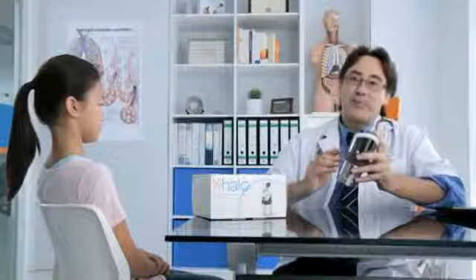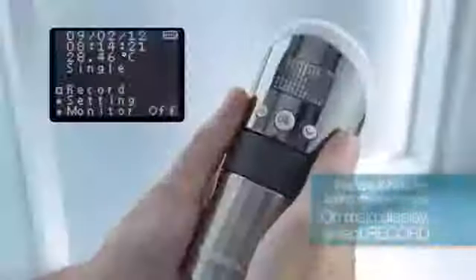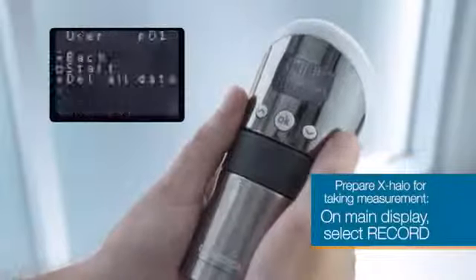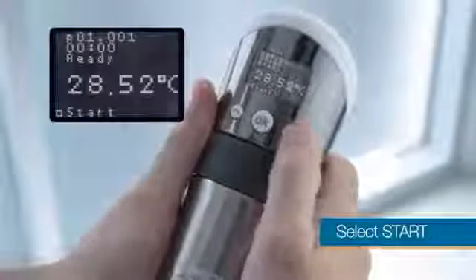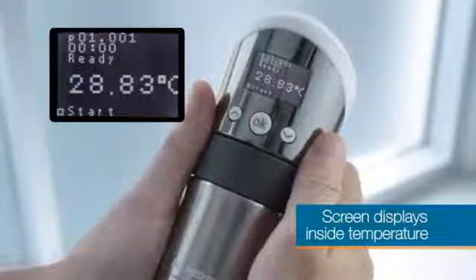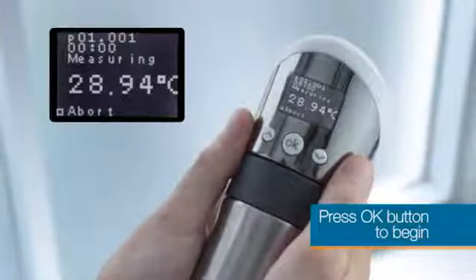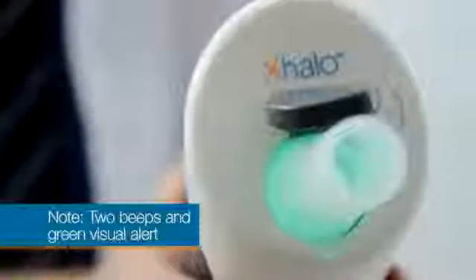Before giving the device to the patient, we need to prepare it for making a measurement. On the main display, select Record, then select Start. This will ready the exhaler, as indicated by a single beep and an orange visual illumination of the mouthpiece. The screen now displays the inside temperature of the device. Press the OK button to begin the measurement. Two audible beeps occur and a green light appears on the mouthpiece.